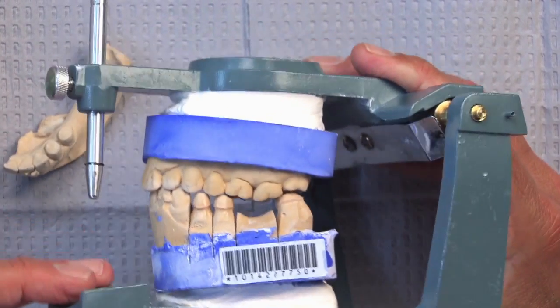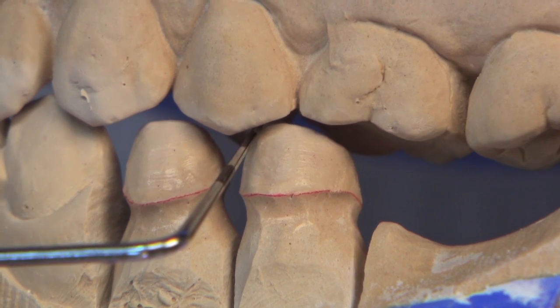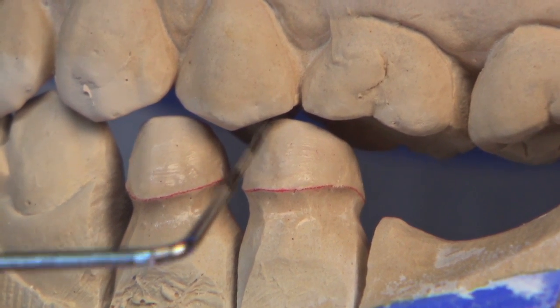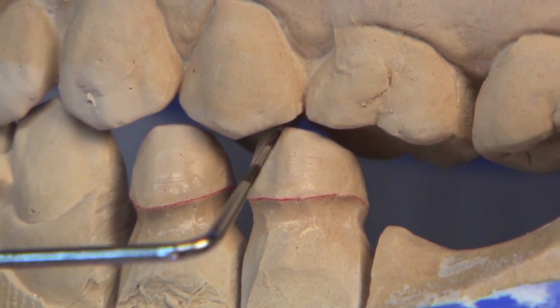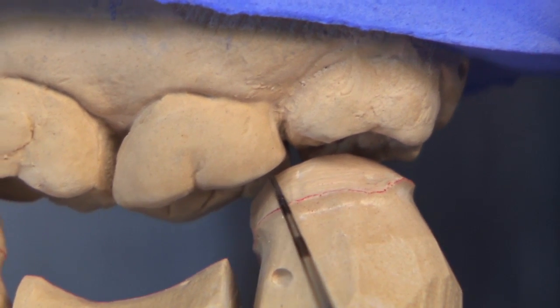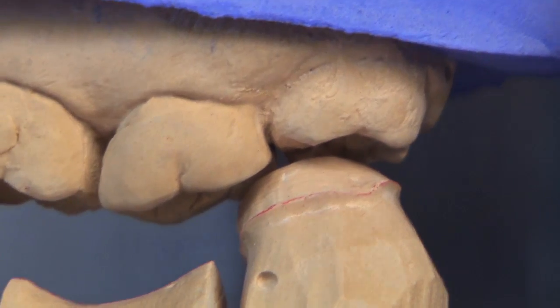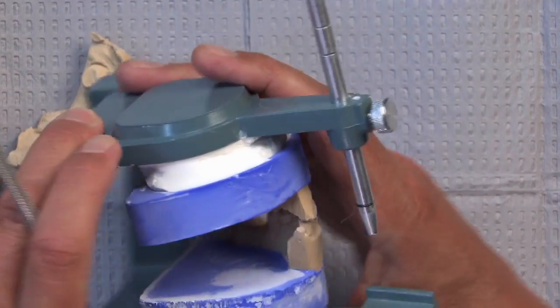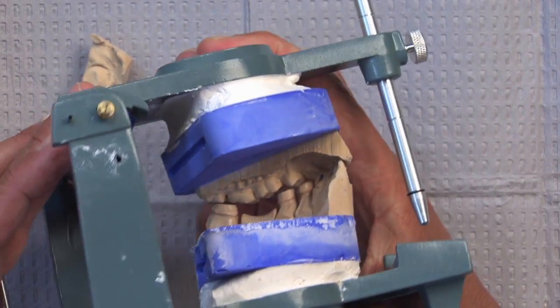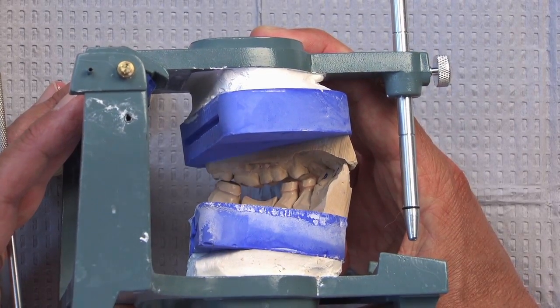Beyond that, remember when we looked at the occlusal surface of the bicuspids, it looked like there was still some anatomy. And you can see as we zoom in here that there's really not a lot of occlusal reduction that was done, and we're very, very short on space. The same holds true for this molar as well. We can look at it from the lingual and see the same thing, that we're short on space. So this is problematic. We don't have enough room for a PFM bridge, obviously.